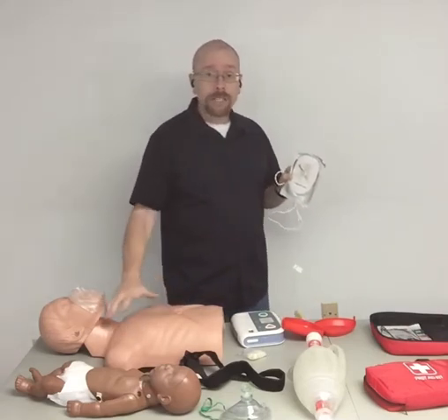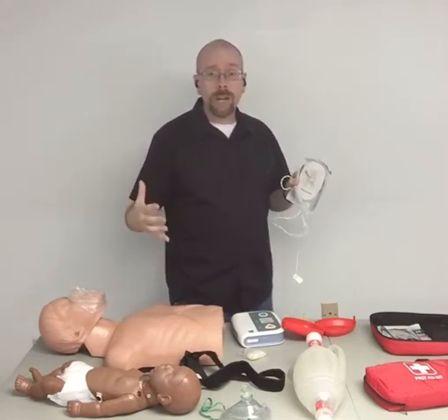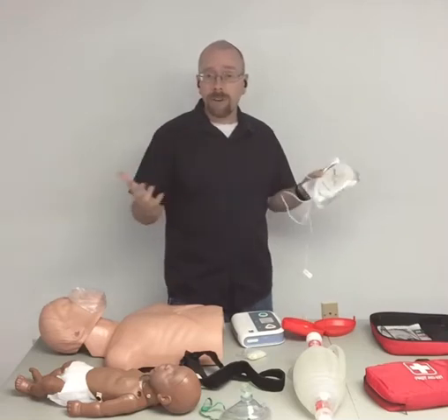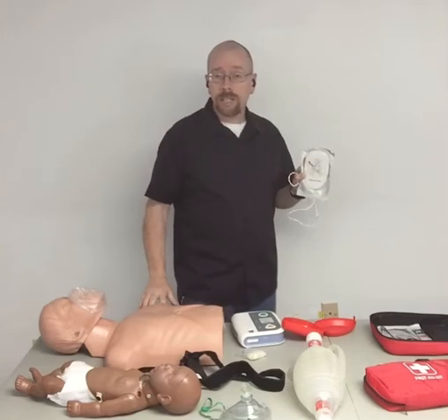If the person has any moisture on their chest, maybe we pulled them out of the water, maybe they were sweating because they were having a heart attack, diaphoretic they call it. If the person's sweaty or wet, dry off their chest with a towel.